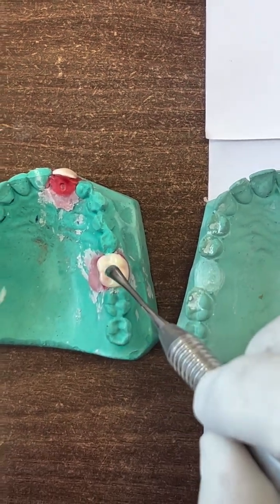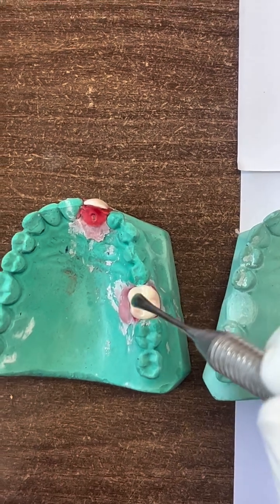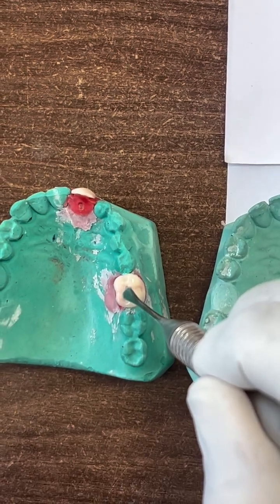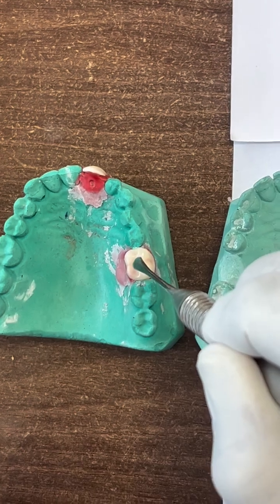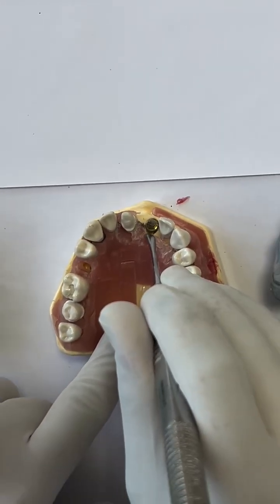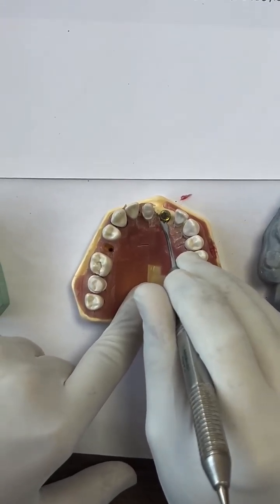But this will give us a very helpful aid in placing the implant in the perfect 3D precise position, because after giving anesthesia to the patient, we will make a small hole through the gingiva into the bone cortex, just like perforating it slightly, to have a basic idea where the future crown will be placed. And after the reflection of the flap, we will proceed with that small hole.